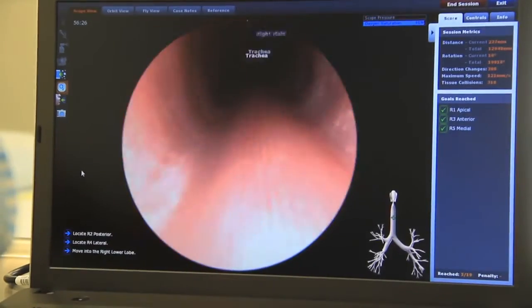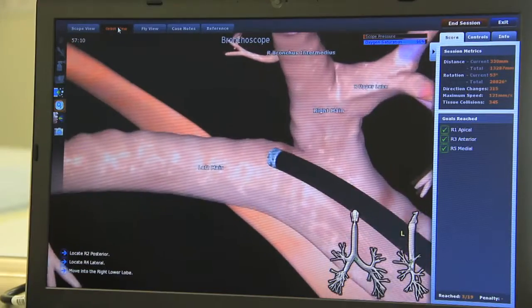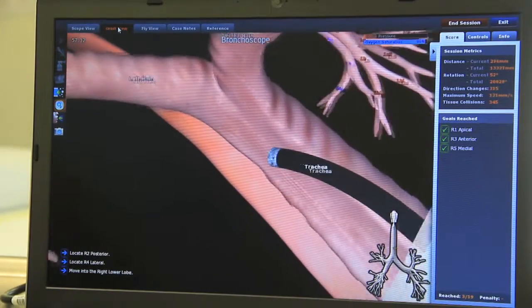I believe the more realistic your learning experience is, the easier it will be to transition from a simulator to the real clinical environment. A lot of thought has gone into the design of the Awesome — we put huge effort into the graphics and we're very excited about that.